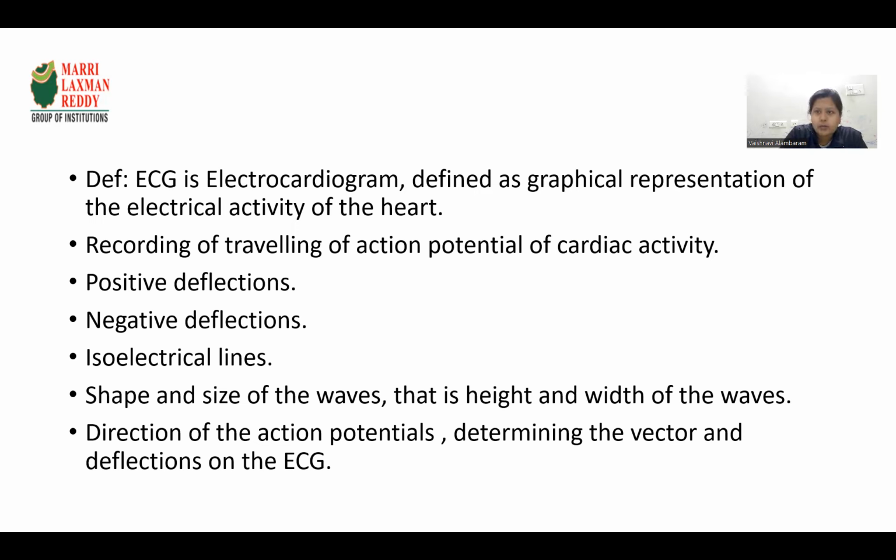If there are any conduction problems, in the case of myocardial infarctions, arrhythmias, heart blocks and all, you have the significance of ECGs. These action potentials in your entire cardiac activity will be recorded on the ECG.